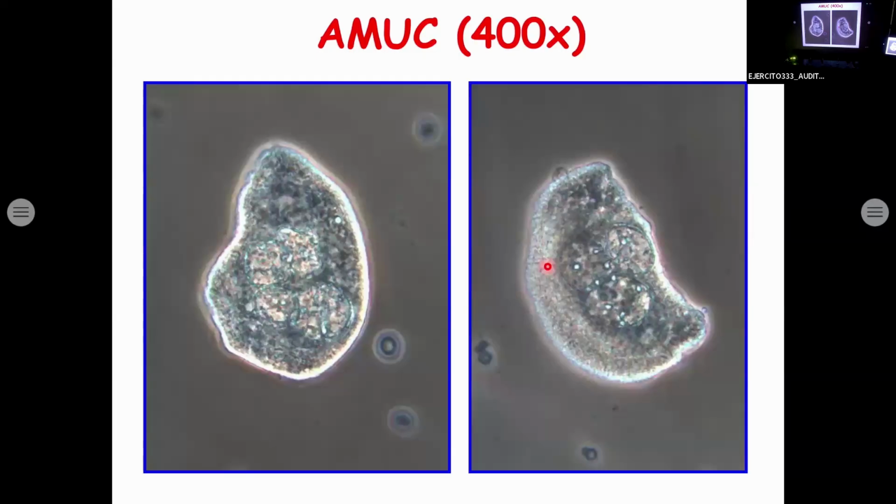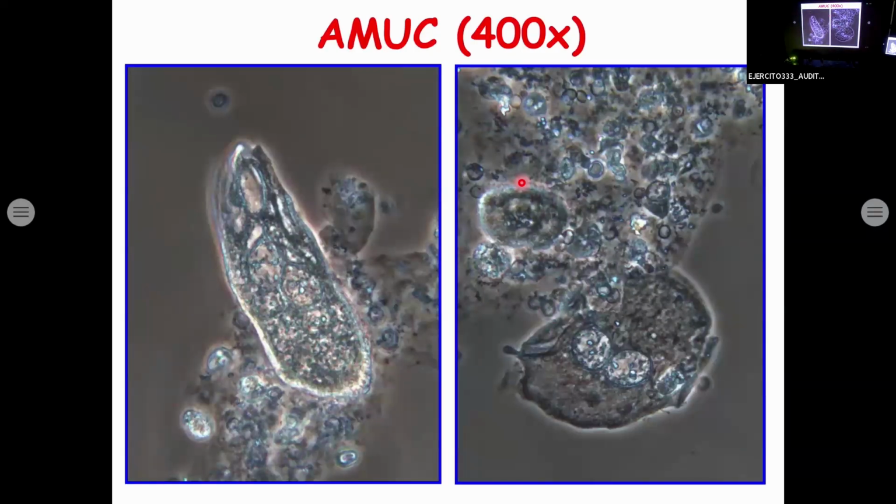Do you think that this might be a cylindrical cell? You don't know. Okay, I go on. Then this might be a so-called cylindrical cell. Again, a very large cell with an elongated shape with at least 3 nuclei. Here again, a large cell with 2 large nuclei.